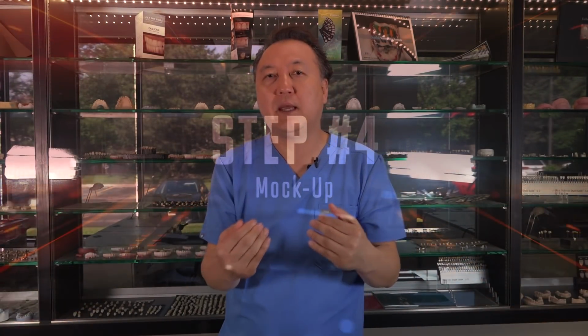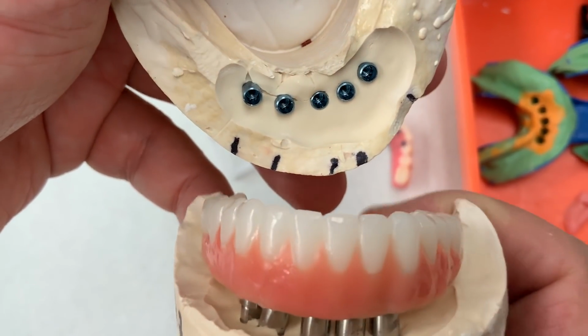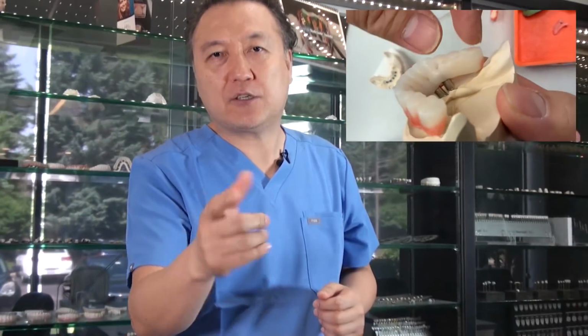Number four, after we prep it, we set the teeth or make a diagnostic wax-up roughly, which I call a mock-up. After we make this, we do the contouring and better shaping, which is my part. I put more passion into making it look like the tooth as close as possible. My recommendation is, if the doctor has already prepped, that's great. But if I prep, I do have limitations, so I always make it a little thicker than they think, because I don't want any fracture. Nobody wants that.